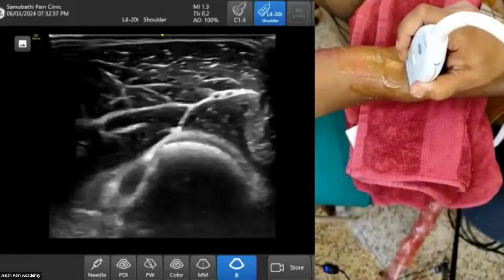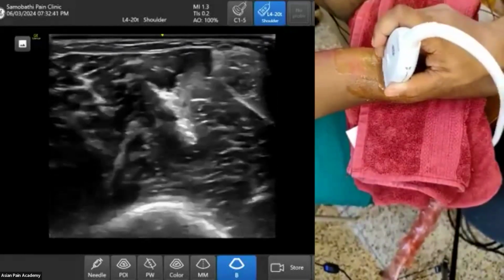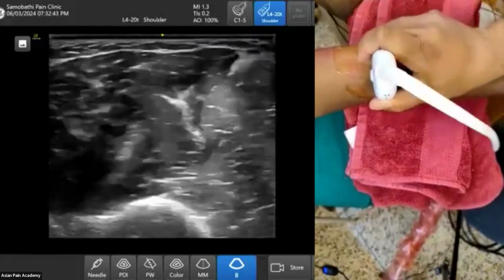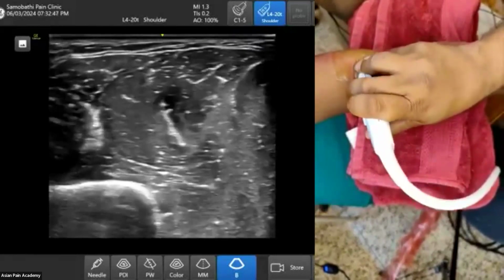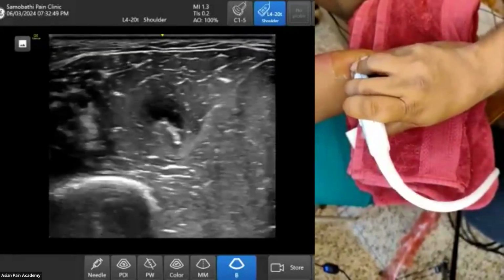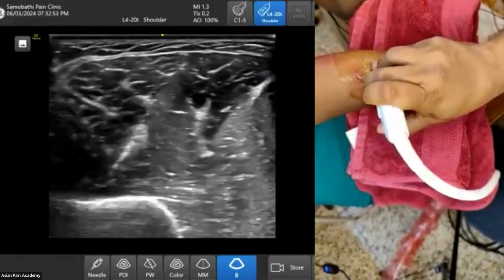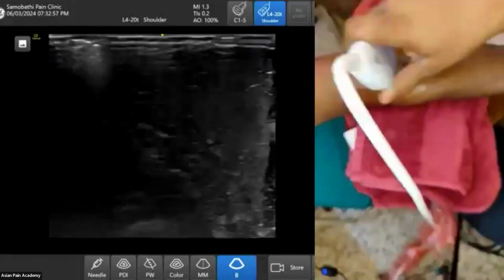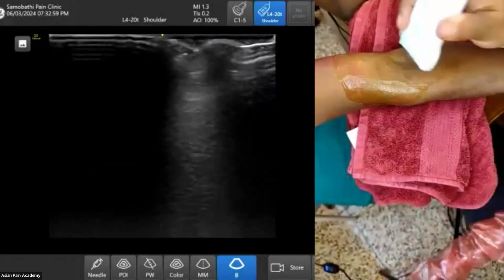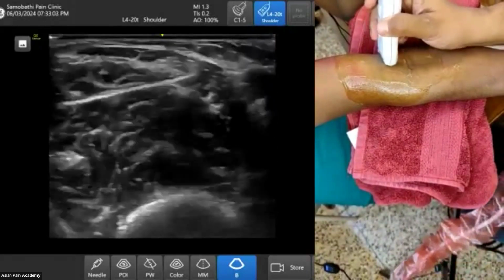Again, coming back, these two nerves are moving. Now it will go to the posterior side. I am not following it, because for this batch I think we do not have this nerve tracing. So we will locate the most important areas.